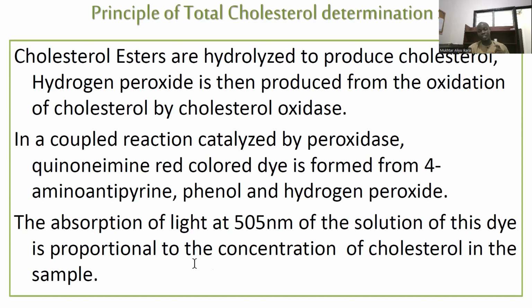So if you are able to get the absorbance of the quinone imine at 505 nanometer, then the absorbance is directly proportional to the concentration of the cholesterol, meaning that the higher the concentration of the cholesterol, the higher the absorbance. So the higher the absorbance, the higher the concentration of the cholesterol.